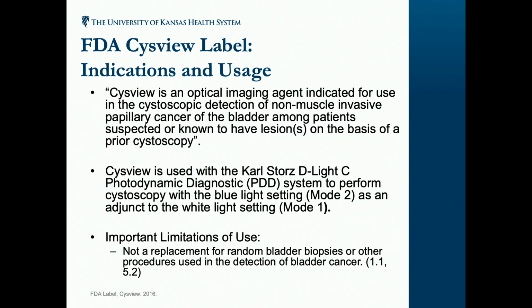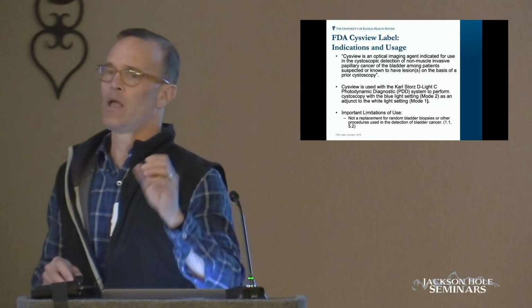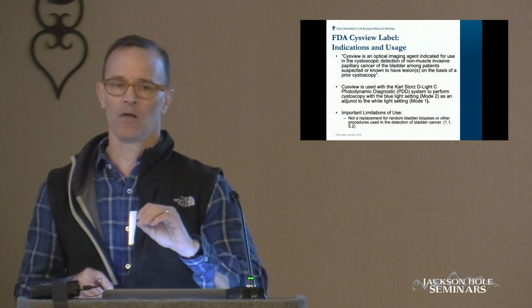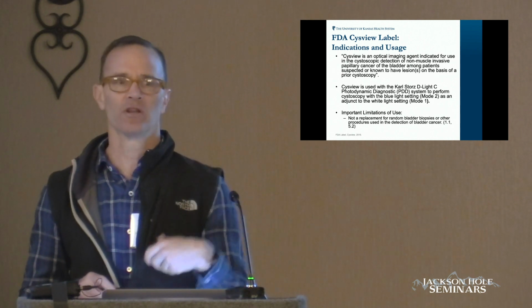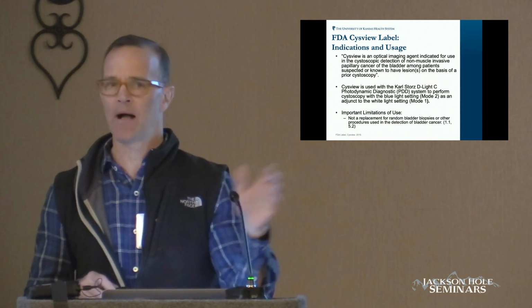So here are the FDA indications, and I won't go through these too much in the interest of time, but it's just to point out that this is not a replacement for cystoscopy or biopsy. That's still necessary. It's not like you're just going to use a blue light and say, oh yeah, they had a tumor, and not biopsy that.